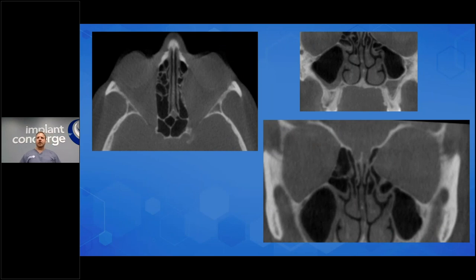This one here, I can't give you 100% diagnosis on this one. Again, we can lead in one direction. It's a very interesting finding because the dentist has to make this decision at this point: to follow up, refer them, find a little bit more medical history. But that smaller hypoplastic sinus is definitely variation anatomy. You can get what's called a smaller maxillary sinus if the patient has what's called silent sinus syndrome, but you're also going to see the cortical outline being a little bit more thickened.